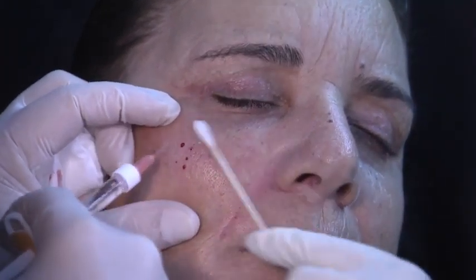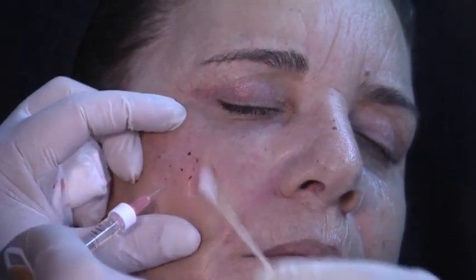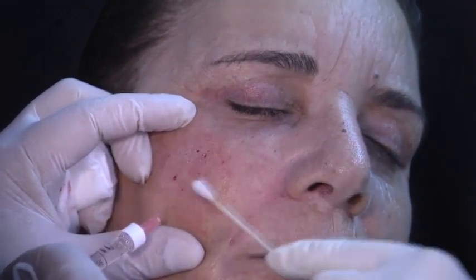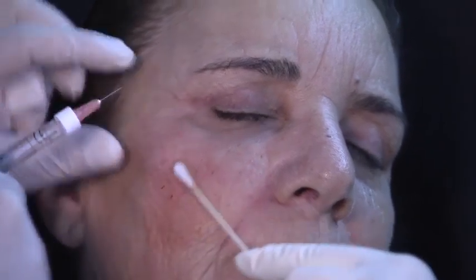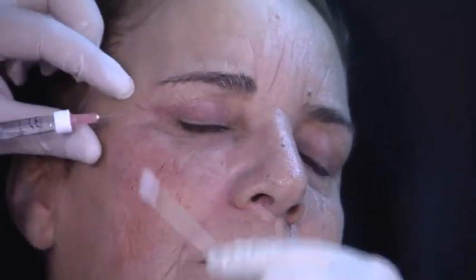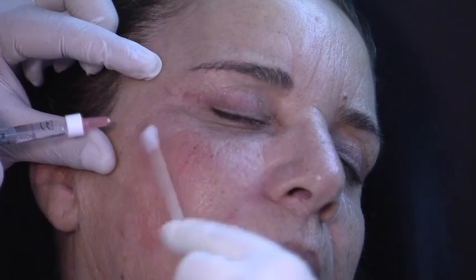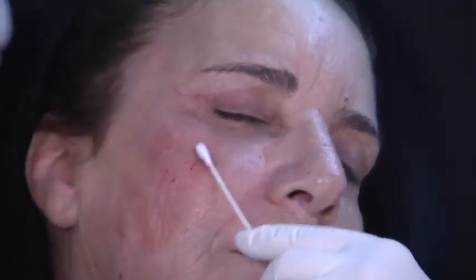So look at the angle. If I go completely perpendicular, I might go through the skin and it's more risky. I want my product in the deep dermis or immediately subcutaneous, and I have one click, click, click, click. Every centimeter I normally have one of these points. Obviously, patients are gonna bruise with this technique. I always tell my patients that they are gonna bruise. I recommend arnica cream or something for the next days.